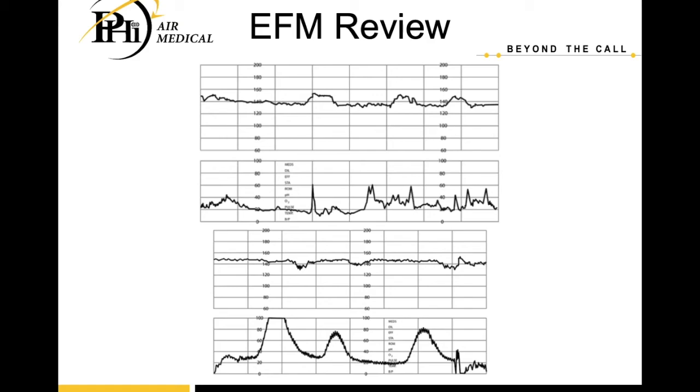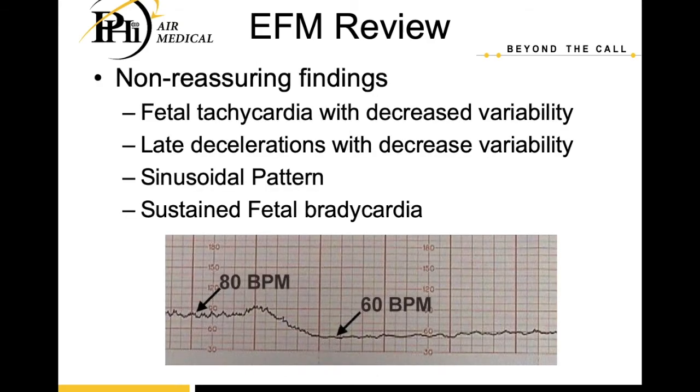So right here we can see that the top one, we are looking at some accelerations, and so that's a really reassuring sign. And the bottom one, even though we have those late decelerations, we are still seeing moderate variability, and we do see a potential refractory acceleration on the very tail end of that fetal monitoring strip.